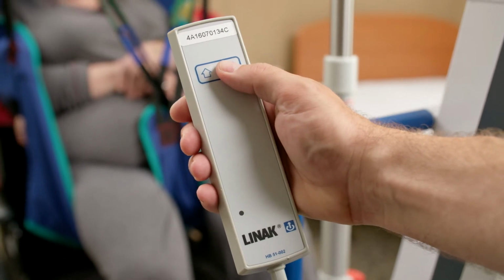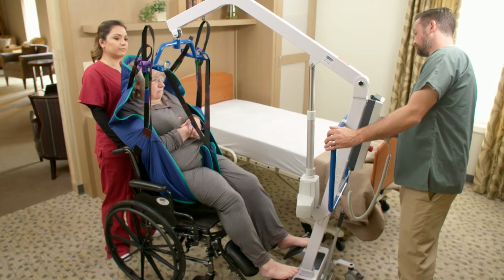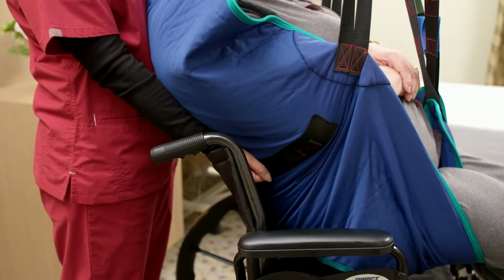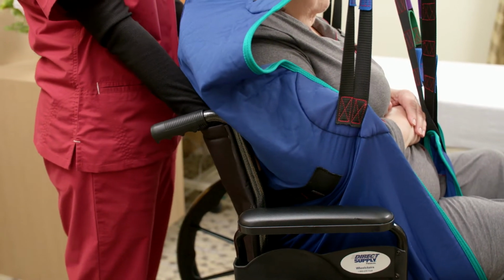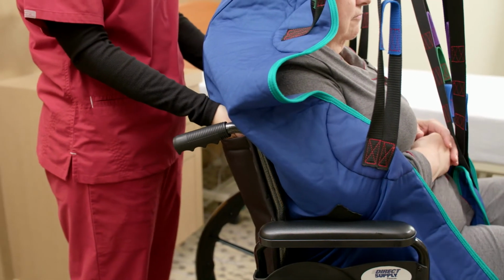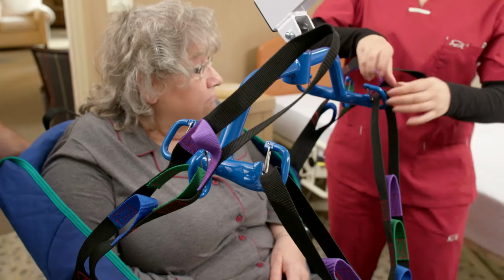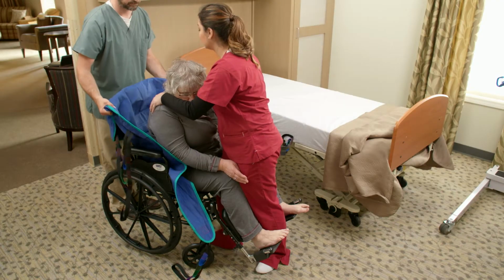2 caregivers are recommended for this step. One assistant will stand behind the chair and the other will operate the lift. The caregiver behind the chair will pull back on the grab handle, available on select models, or sides of the sling to seat the resident well into the chair back. This will help maintain a good center of balance. Take care to prevent the chair from tipping forward. Remove the sling from the resident.